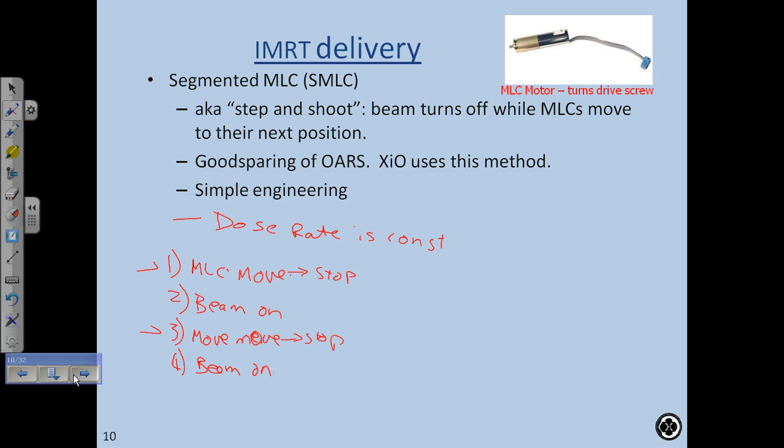This is a more efficient way of delivering the dose because the step and shoot MLCs deliver a larger field. Okay, so a larger field compared to sliding window, and I'll show you that in a minute. So the field is relatively large, and I'll show you what a step and shoot might look like. I'm just going to put some leaves in here. It might look something like this.